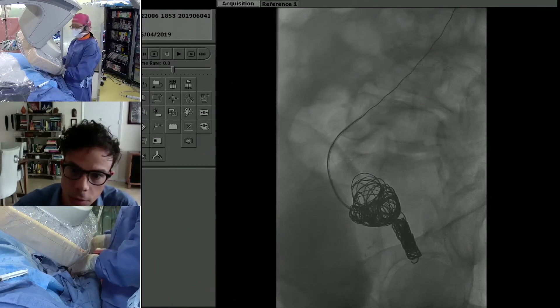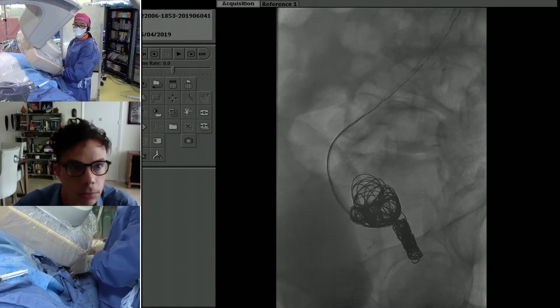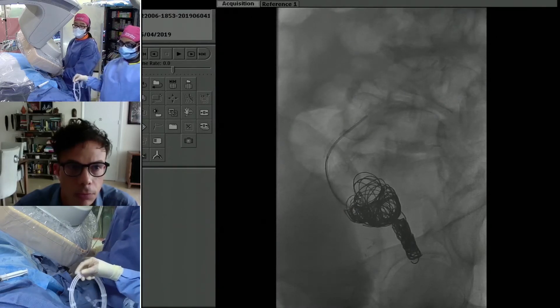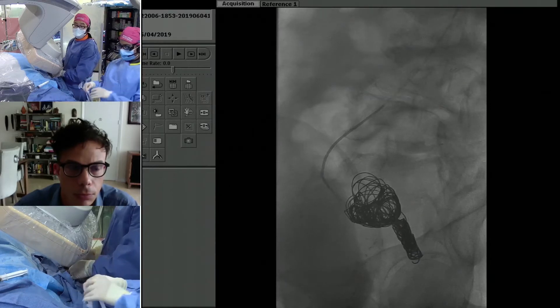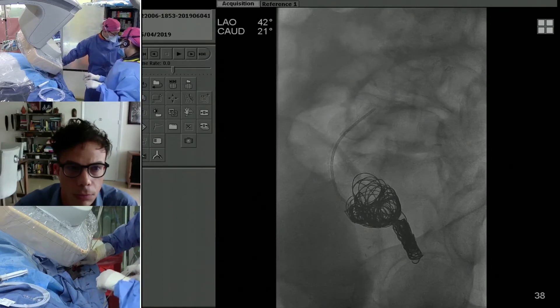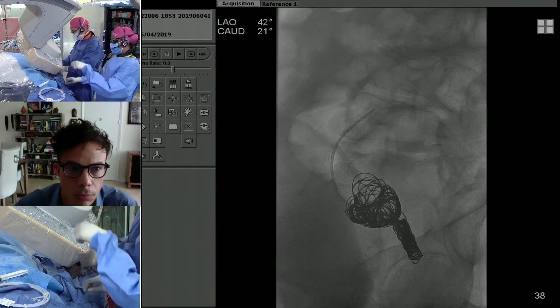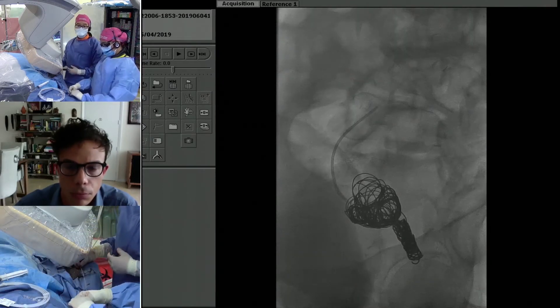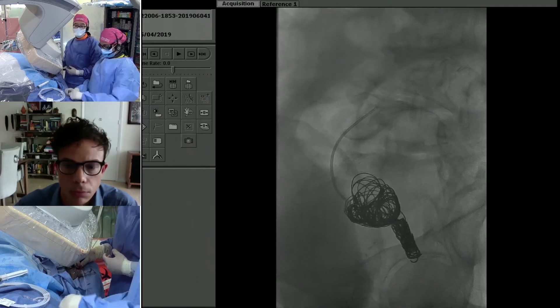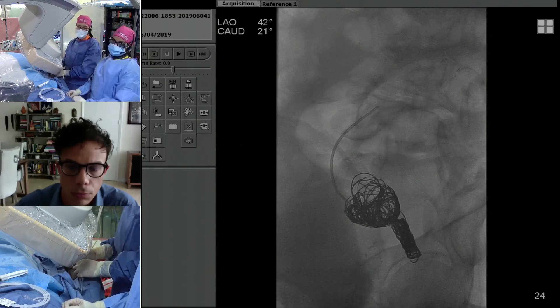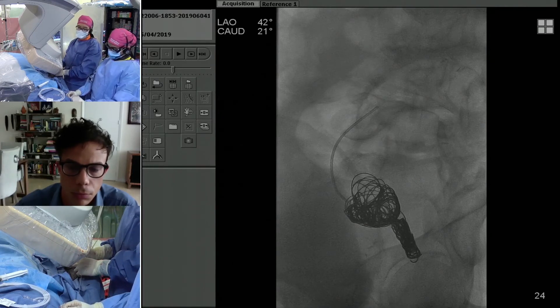When we say we're waiting about a month, we're looking to see how bad the buttock claudication is going to be. For this patient, we're going to be landing his contralateral IBE pretty far in to gain seal of that iliac aneurysm as well. Whenever you go a little deeper into the hypogastric, you run the risk of the stent patency becoming a little lower. If he ends up developing buttock claudication with just unilateral embolization, we'd extend that out further than one month, which is why it's important to embolize this now as far back to the origin as possible, rather than just coiling the outflow.